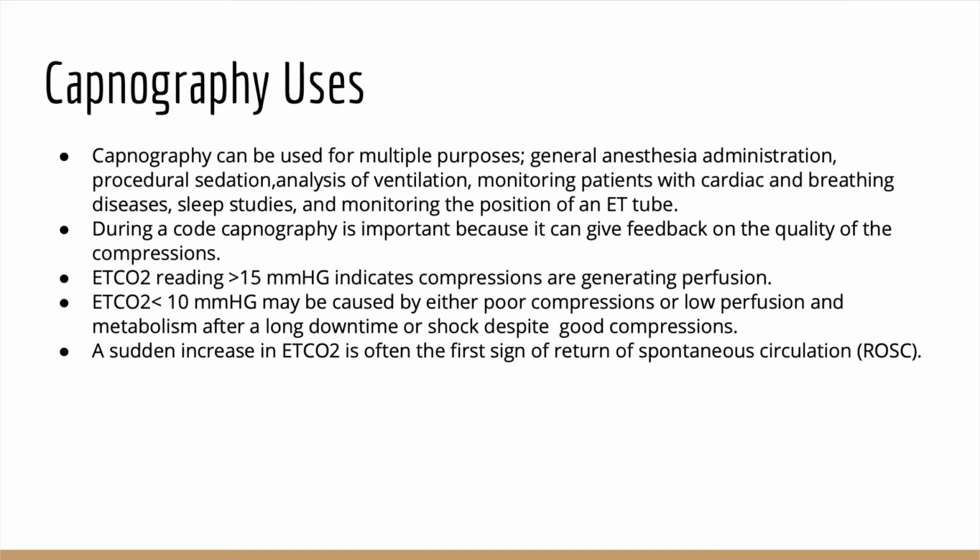So there's a couple different things that we use capnography for. Capnography can be used for multiple purposes: general anesthesia administration, procedural sedation, analysis of ventilation, monitoring patients with cardiac and breathing diseases. It can be used in sleep studies and monitoring the position of an endotracheal tube.